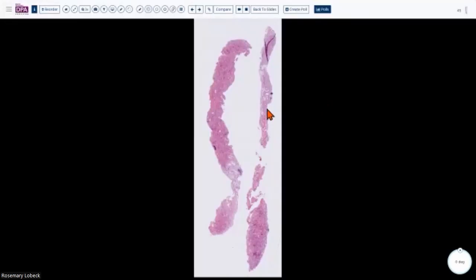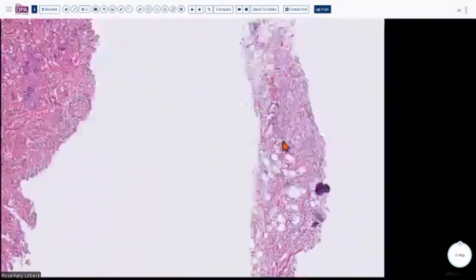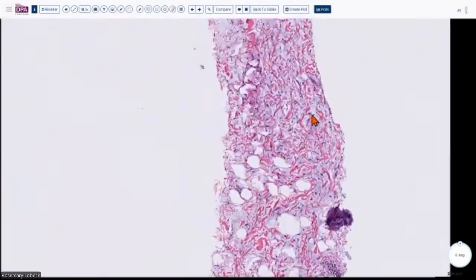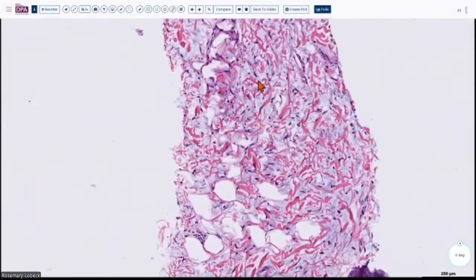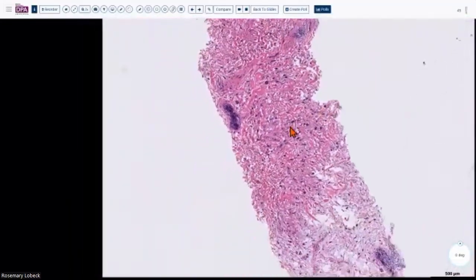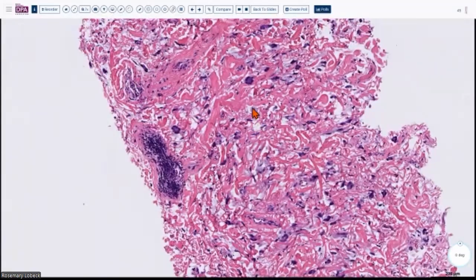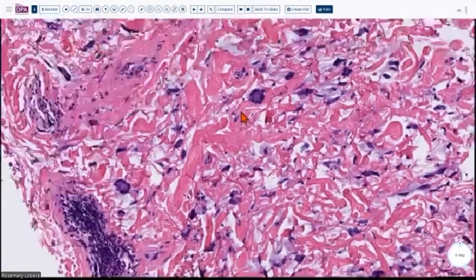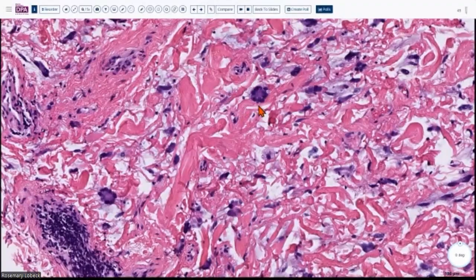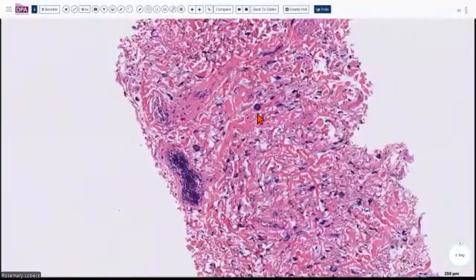So finally, I want to end this topic with this particular case that we got recently in our practice. This is a lesion that is fatty. It has some myxoid change, and it also has this ropey collagen and spindle cells. So all features look good for spindle cell lipoma, right? But then if you go into this area over here, again, you start seeing our usual culprits, the pleomorphic darker cells with larger nuclei. In this case, though, if you zoom in, you will see it's not a single nucleus. There are multiple nuclei over here, arranged in a wreath-like fashion all around the cytoplasm. So this would be your floret-type cell, and that would make it a diagnosis of a pleomorphic lipoma.